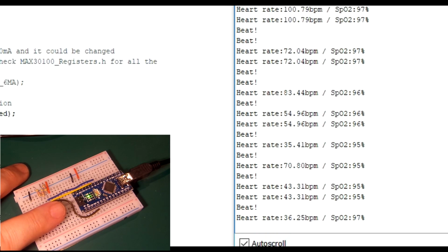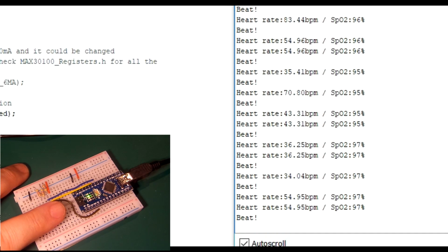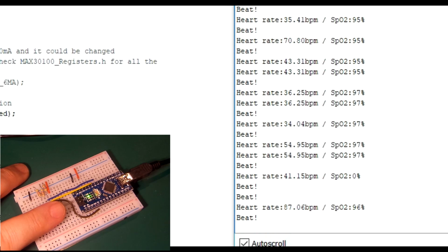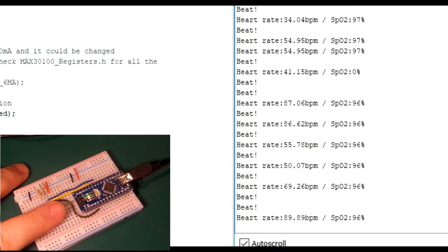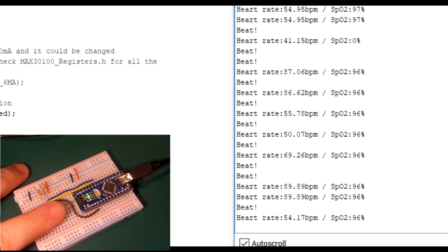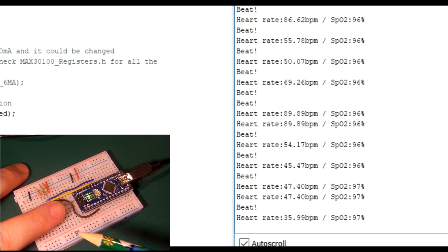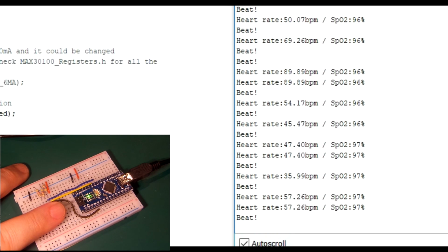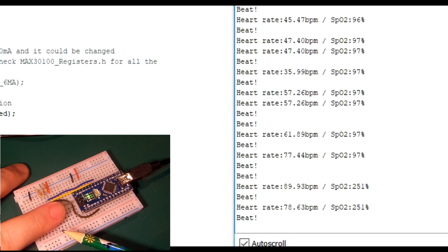But generally, this is not as bad or as sensitive as those cheaper sensors, the ones with a little heart symbol on it, that little round thing. If I apply more pressure, it does fluctuate for a second or two, but then generally it settles down. You can't see this happening, I promise. I am actually applying more pressure down the finger in a second. I'll do it now. So I'm pressing quite firmly on this sensor now.